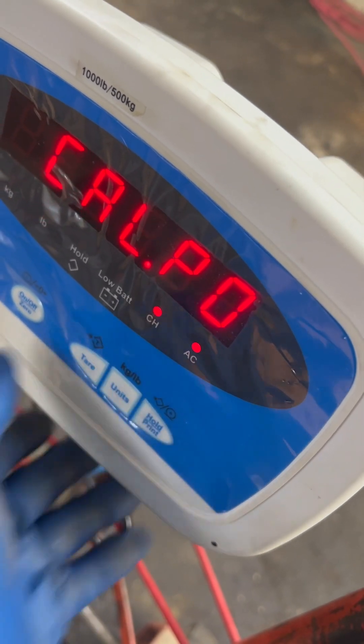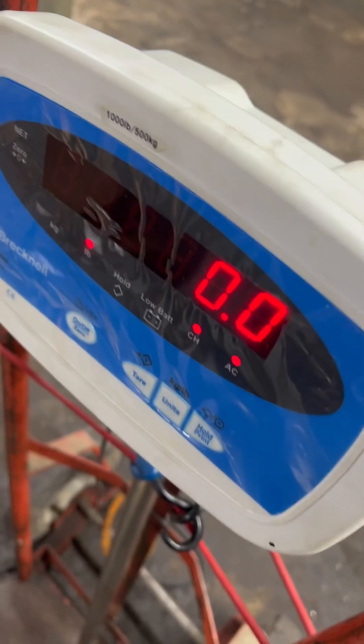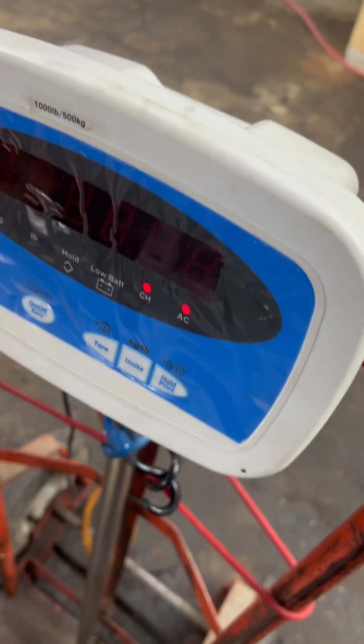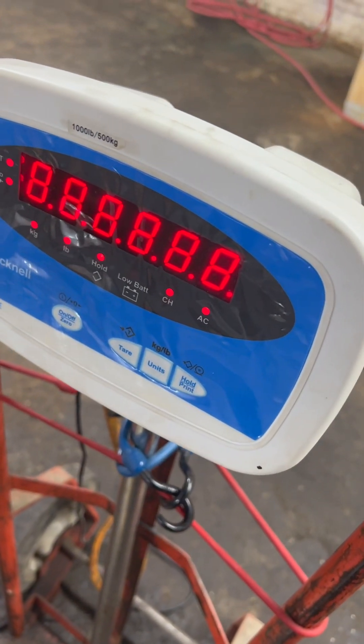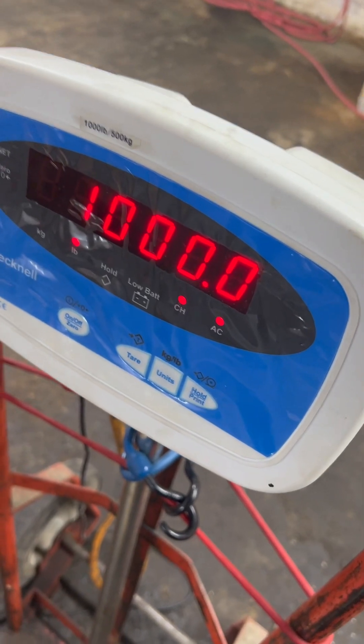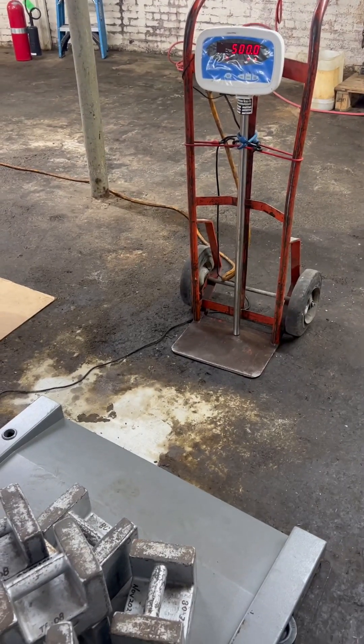I'm just going to do this. At this point, you're going to do another zero. Bring it off, press tare again. And that's how you adjust the calibration of a Brecknell SBI-100.